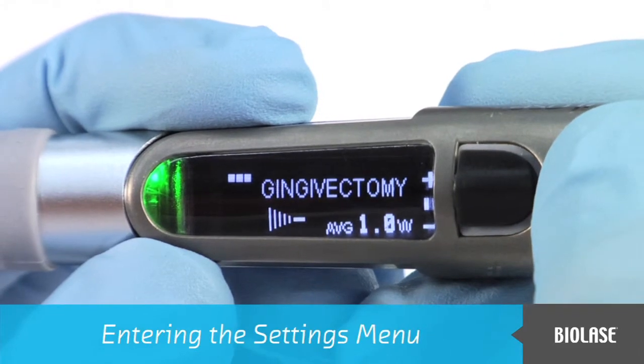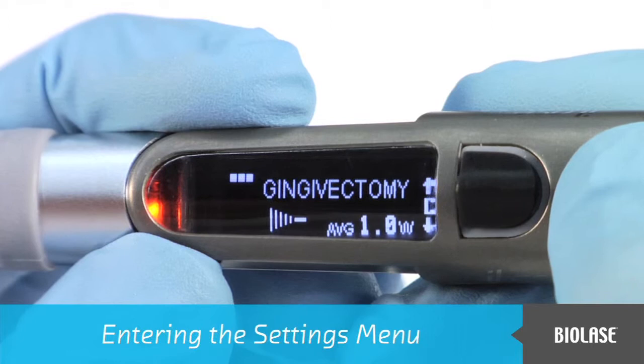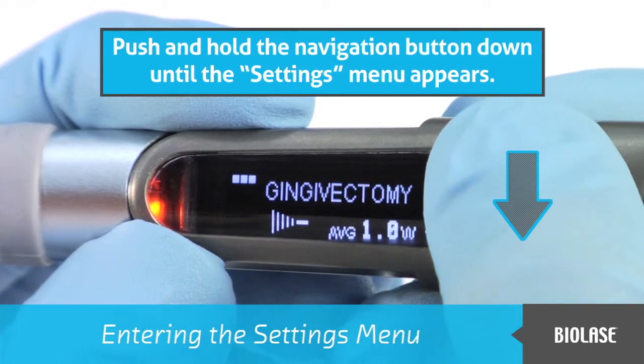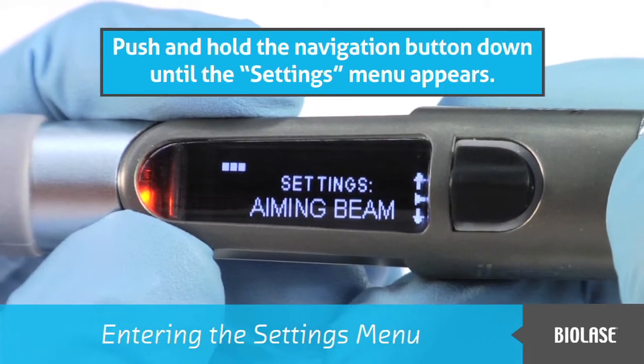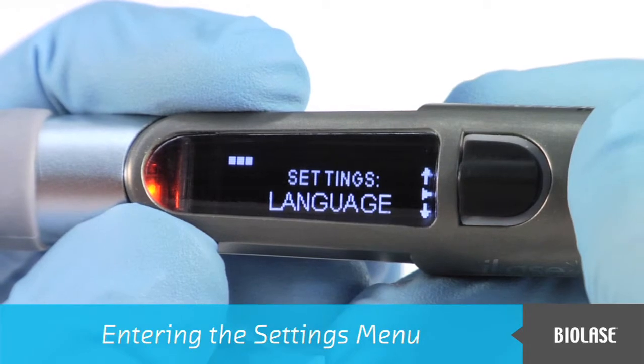To enter the Settings menu, first place the iLase into standby mode. Then, from the main screen, push and hold the navigation button down until the Settings menu appears. You may scroll through the different choices with the navigation button.